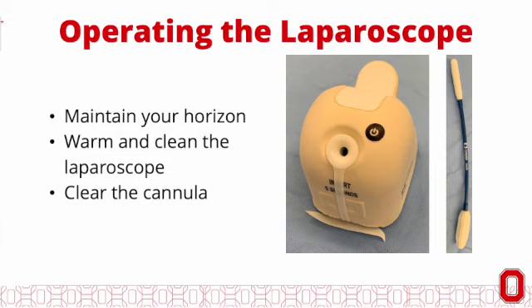In addition, the ports need to be periodically cleaned throughout the case. This can be done using a large swab pictured on the right, provided by the technician. Warming the laparoscope and cleaning the port sites are roles commonly performed by surgical technicians or medical students. Please only do so when instructed.